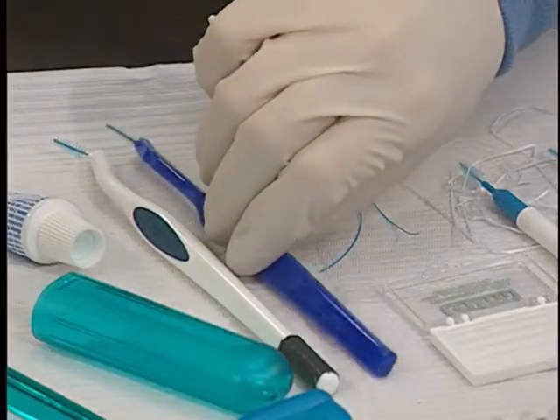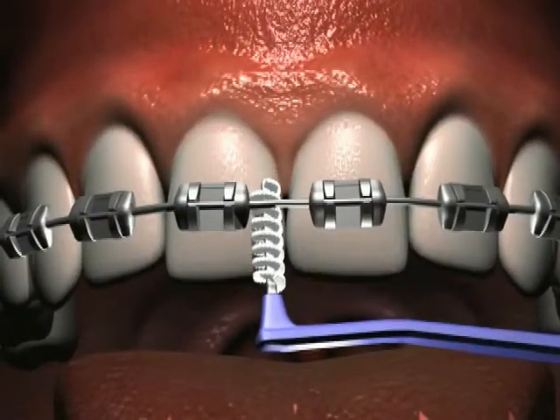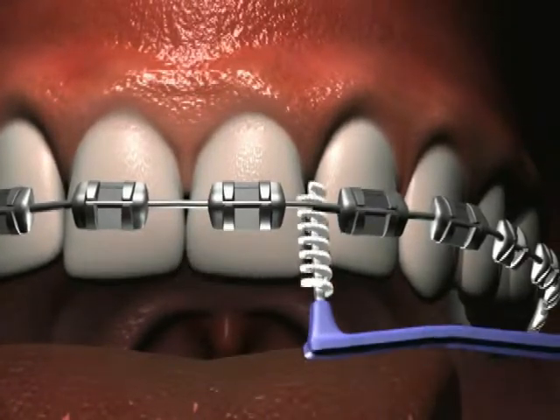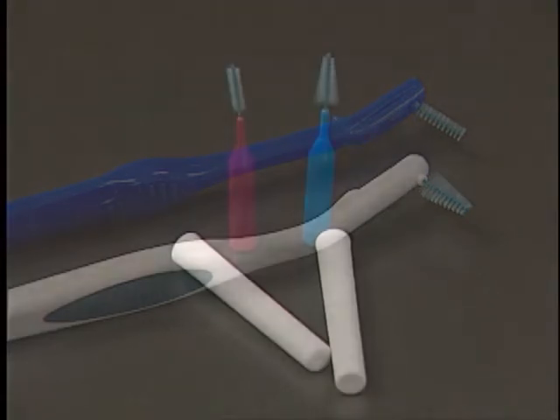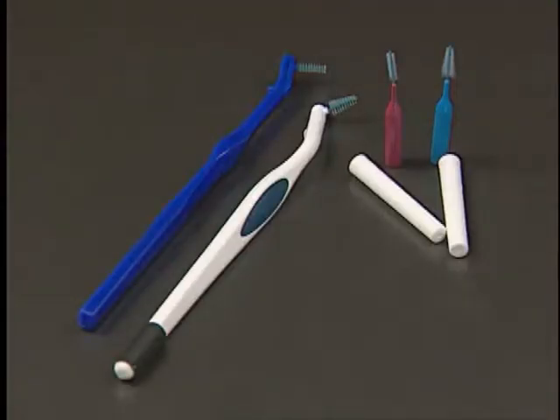Now, here's something else to help you clean, an interproximal brush. It's designed to reach between your wires and brackets and between your teeth and grab the plaque and debris that get trapped there. Interproximal brushes come with a couple of different brush tips, a cylinder shape and a cone shape. They also come with a long handle for home use or a shorter travel size handle. Try different ones to see what works best for you.